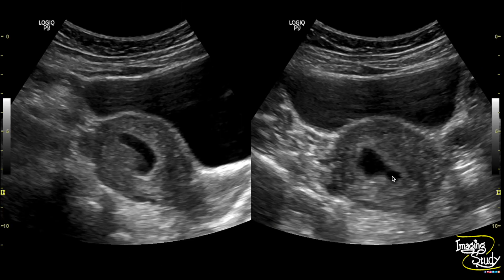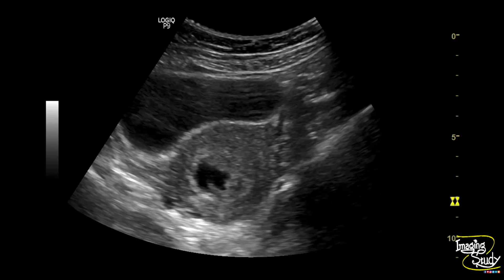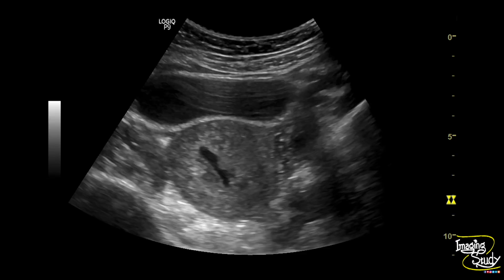Here's the longitudinal and transverse section of the uterus showing an irregular distorted gestational sac within the uterine cavity. This is the transverse section and you can still see the irregularity of the sac indicating the distortion. Another view of the distorted irregular gestational sac.